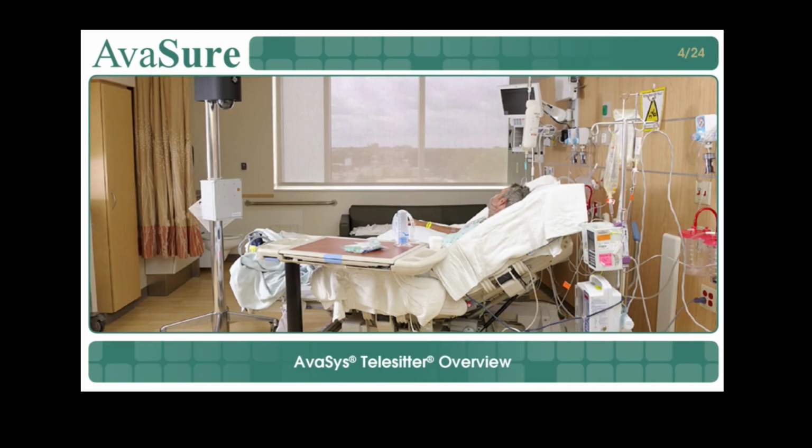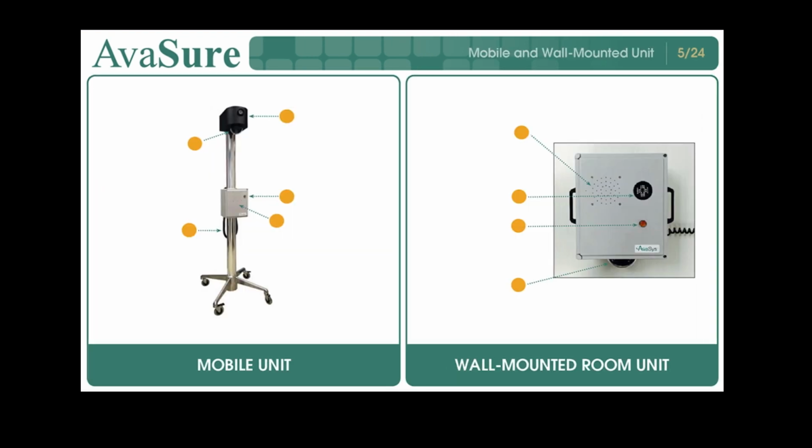Let's start by discussing the different components of the AvaSys TeleSitter system, as well as the monitoring staff role. The AvaSys system has various different units. Here we are showing 2 versions. The mobile unit comes in a wired or wireless version. And beside that is the wall-mounted version.